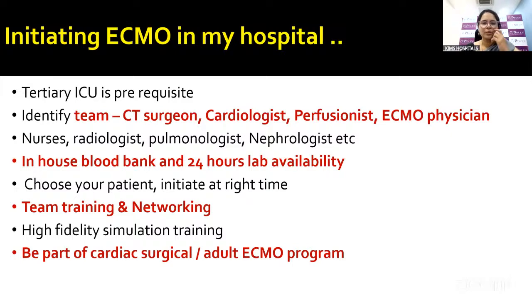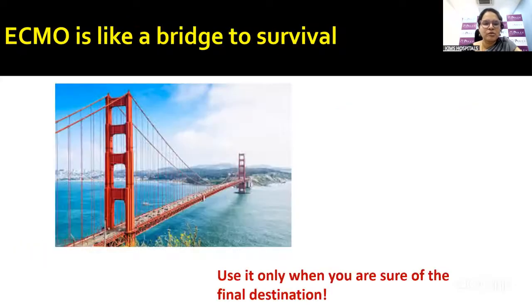So for initiating ECMO in any of your setups, it is important to have the right team, which would include the cardiothoracic surgeon, cardiologist, perfusionist, and an ECMO physician, having an in-house blood bank and 24/7 lab availability, choosing the right patient and initiating at the right time, having team networking, team training, and regular high-fidelity simulation-based training could be important tools for taking this forward in your own setups. But one has to remember that ECMO is only like a bridge to survival, and one should never start venturing into the bridge when the final destination is not clear.